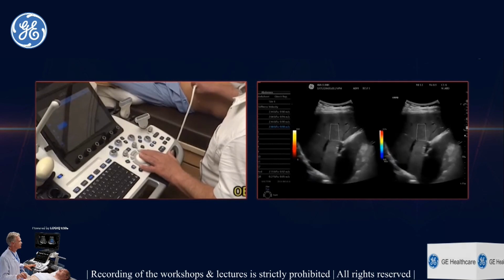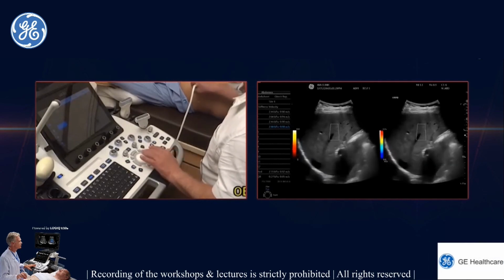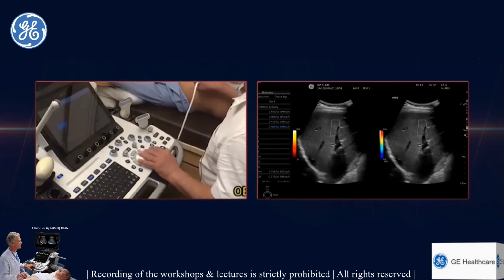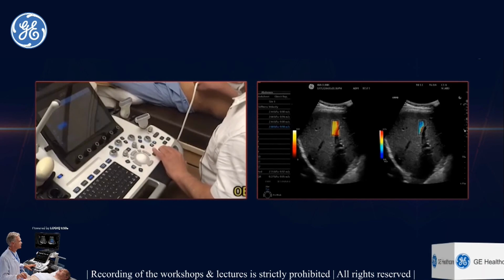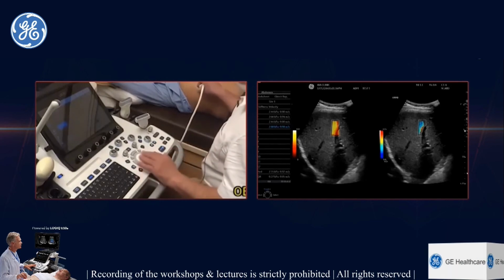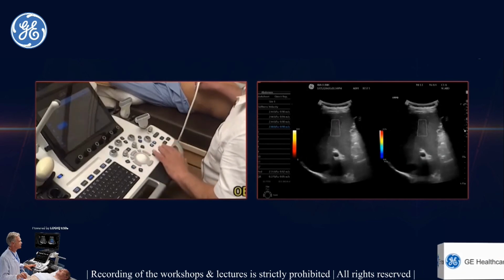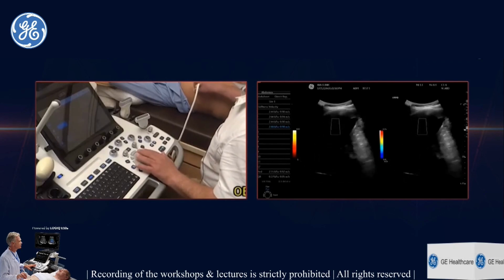And let's see what happens when we take it over the vessel. For example, we will take a wrong technique. And you can see that the quality map is totally distorted. So this is a very good feature of this new technology, wherein it tells you where not to take. And this is in comparison to something like FibroScan, because FibroScan is not image guided. You will not be able to identify an area which is not having vessels, and therefore there will be false results.